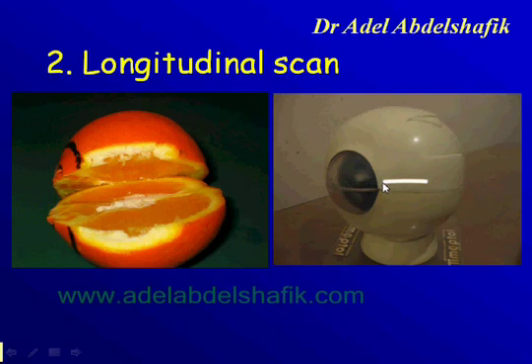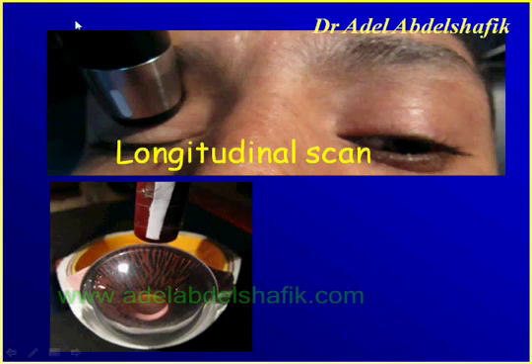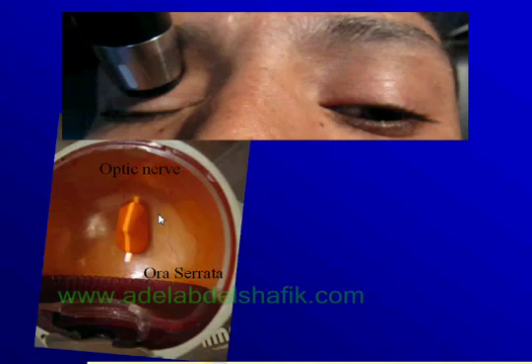Here we get the mark toward the cornea, so the ultrasound will be to the opposite side on the ciliary body. Then the ultrasound will go gradually backwards toward the equator. So we are making a longitudinal section in the eye. Here I'm putting the mark toward the cornea, and the back is toward the equator. Like this, the mark is toward the limbus and the back is behind toward the equator.